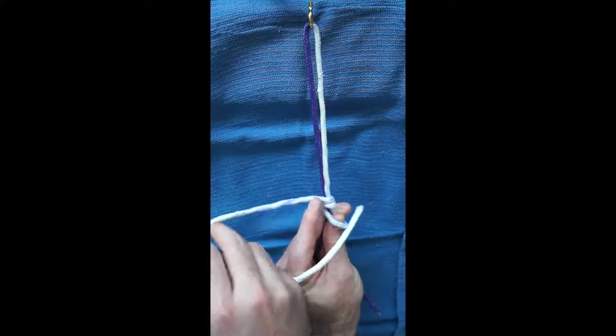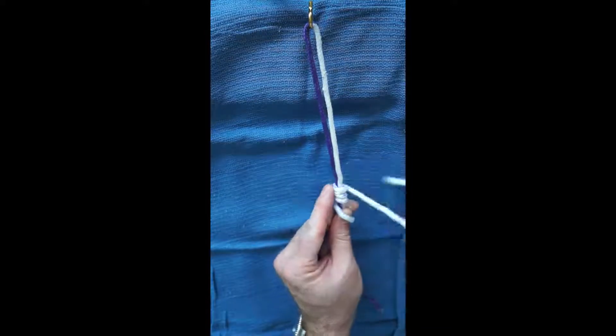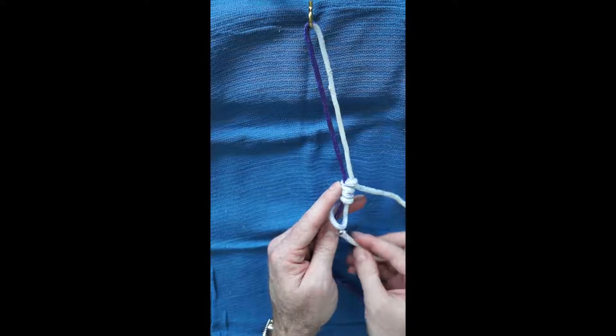Next, the non-post strand is passed around both strands three more times. The index finger on the post hand is used to dress the knot with each pass. The non-post suture is then passed around itself proximal to the knot to create a half hitch.